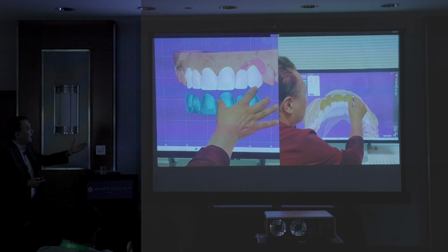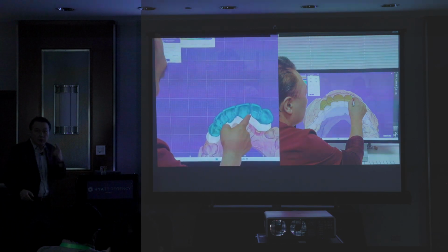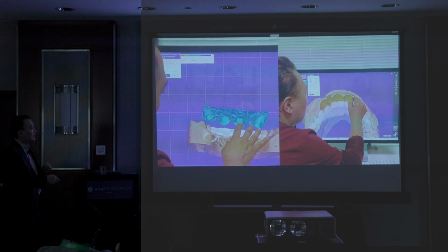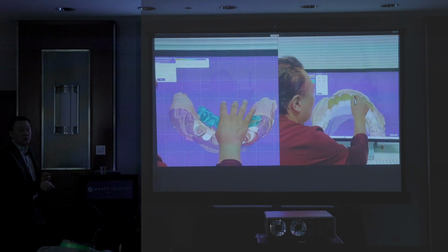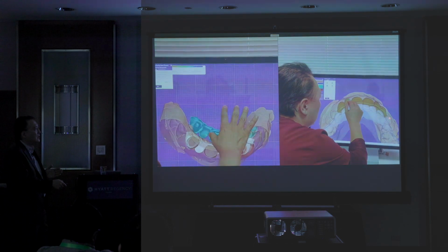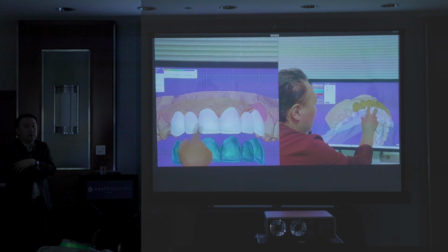So another case, here's my trick. Like I said, I can see the design of the incisor all the way covered. Whenever the doctor says 10 millimeter, right there. 12 millimeter, right there. So I make it really thick. Why? Because I have protection here, so I don't get any chip. But I do need a little bit more facial room, with good alignment. That's the great framework, a good start with that one. Then I can make a beautiful restoration. I can show you later.